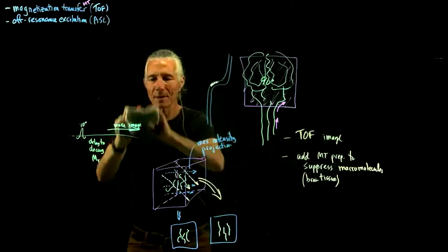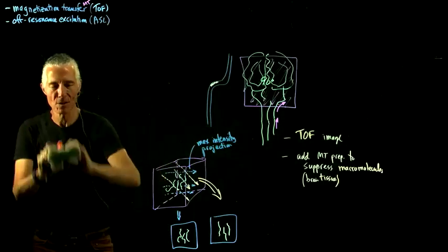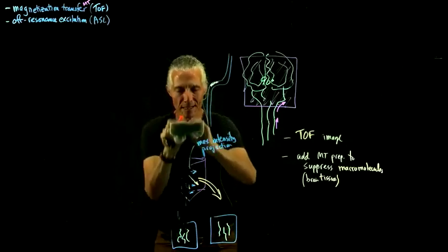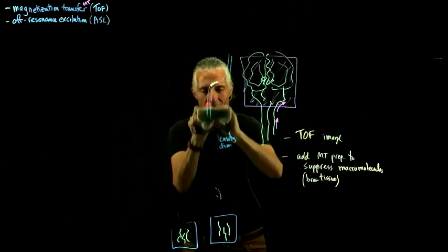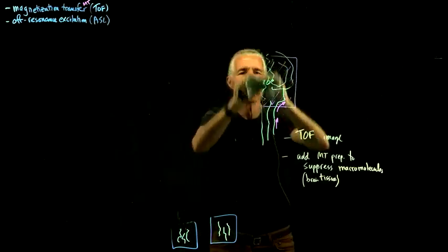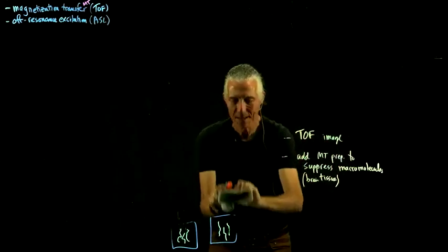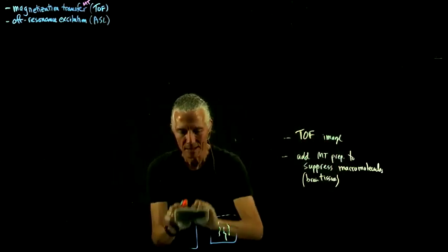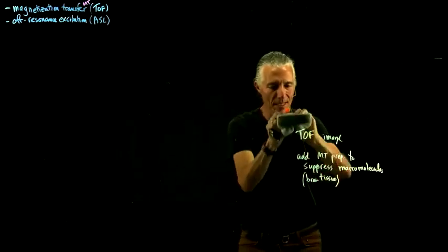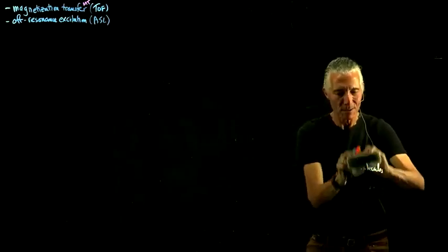And one of the topics, I already went over this once. It's quite a confusing thing, so I forgot to put up some of the labels last time. So I just want to talk about how to visualize off-resonance excitation. The way we visualize on-resonance excitation is very straightforward. We just imagine we're in the rotating coordinate system, and then we just do a flip.